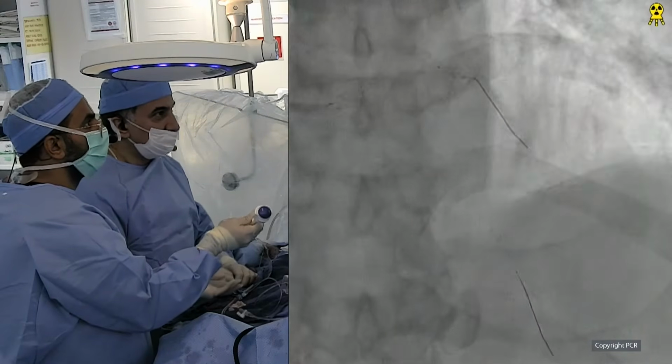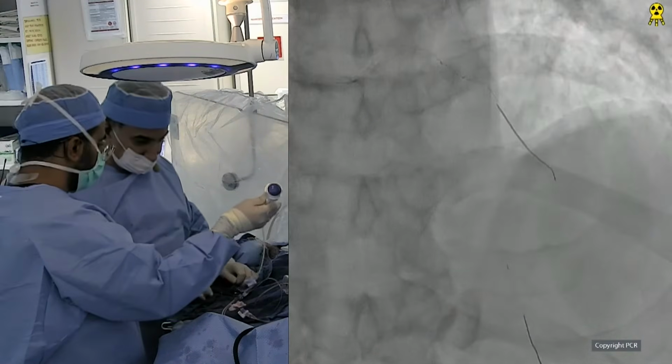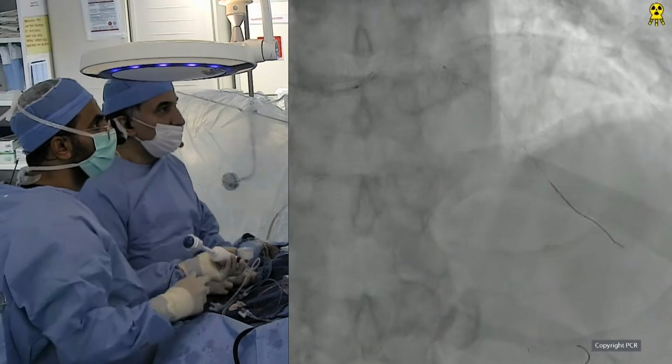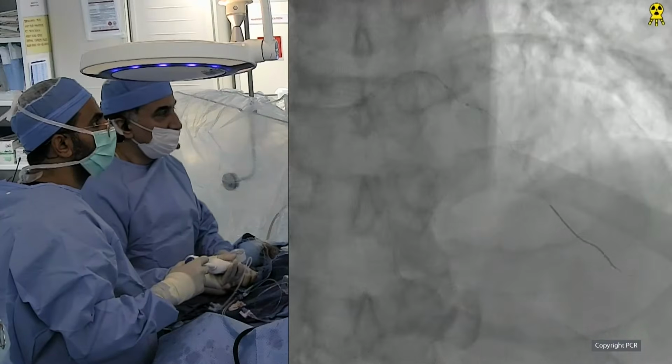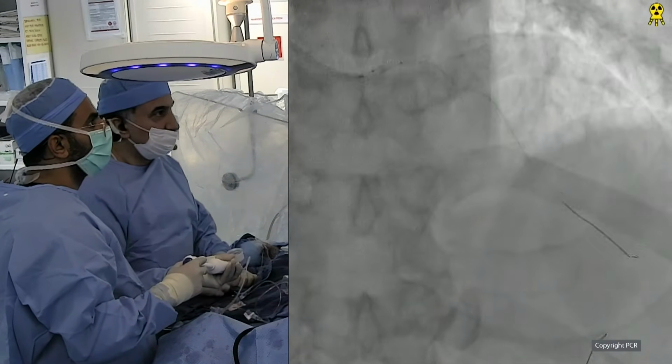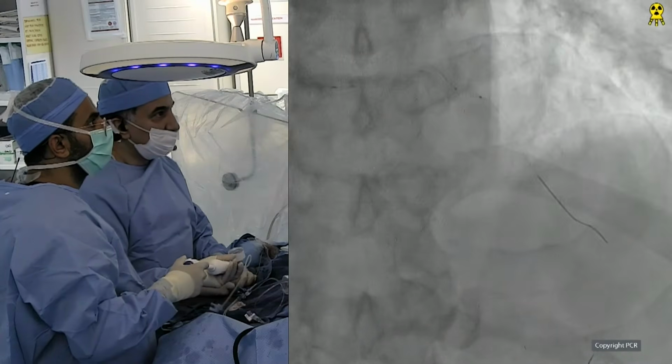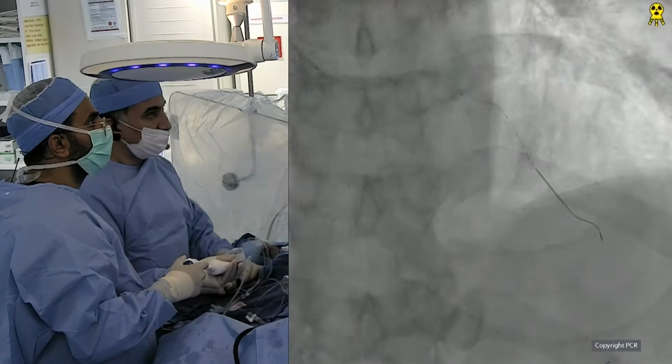And equally important, I think, as we were discussing in the morning, is to select the landing zone exactly, from the distal landing zone. This will also dictate the length. And that is critical to get the co-registration. Angio co-registration, when you fix it, is projecting exactly in your angio where to land distally and proximally.